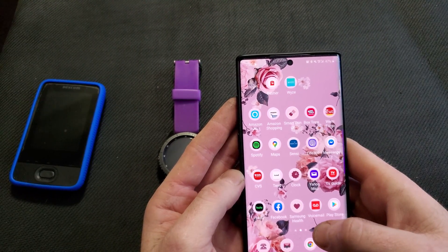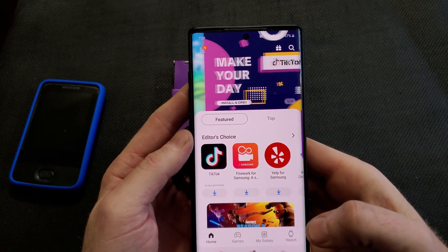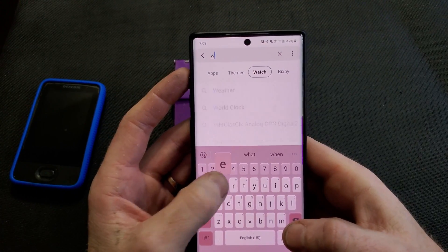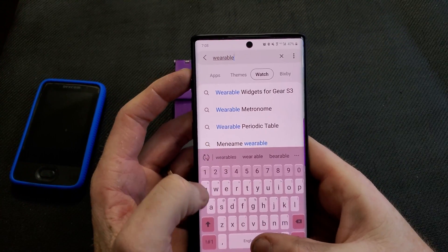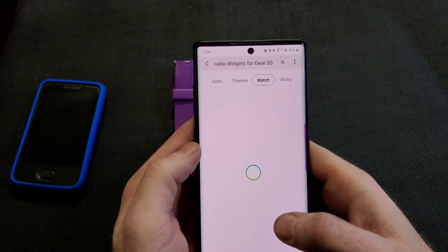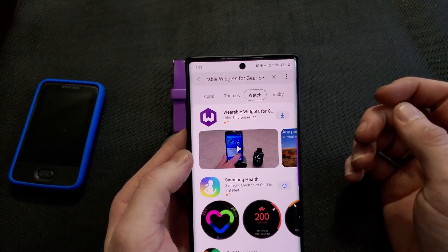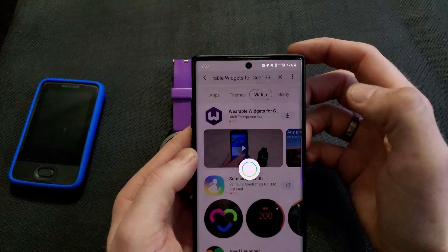Now I'm going to go to my Galaxy app. So now I'm in the Samsung Galaxy app, and I'm going to go to Watch. I'm also going to type in the same — Wearable Widgets. It's that one right there. It'll say it's for the S3 Frontier, but it'll also work for other Samsung watches and the Galaxy watch. So I'm going to download that.